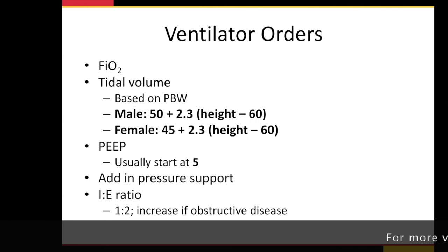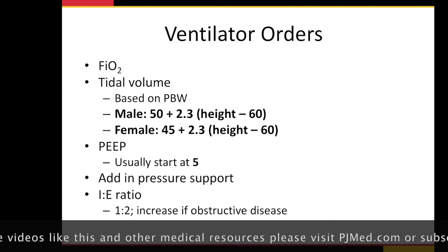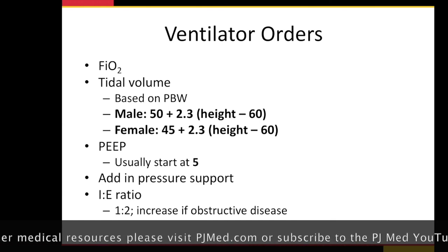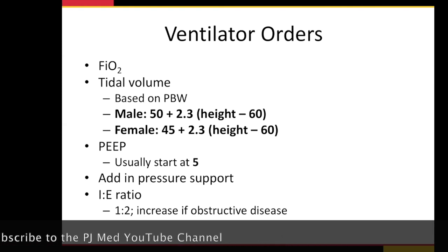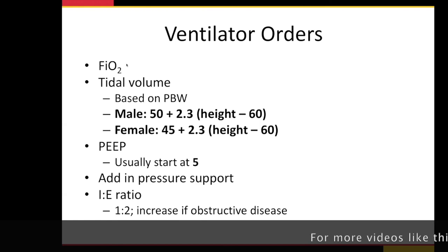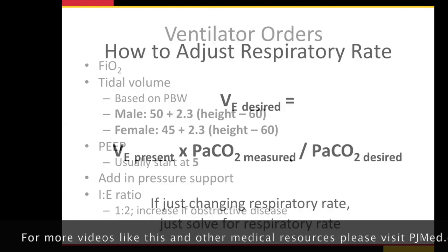Because if you don't, what the ventilator will do is it'll just start trying to stack breaths, or if the patient tries to breathe in between, what you'll wind up with is what we call breath stacking, or dynamic hyperinflation, or auto-PEEP, bad thing. So 1 to 2 is a good place to start. Again, I'm getting a little advanced with this. What I would focus you guys on is, if you're doing this, FiO2, tidal volume, PEEP, and then the last thing is your respiratory rate.